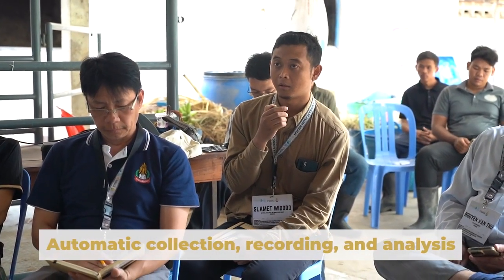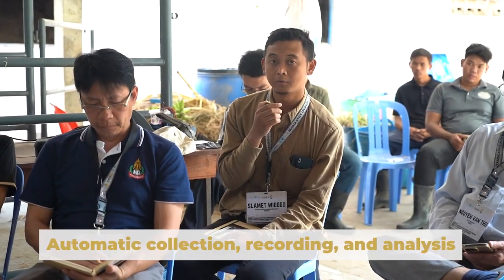My name is Widodo from Indonesia. And we have in Indonesia a Cybel system produced by Cybel System America, and that's an automatic sampler. So we have 4 headboxes in Indonesia, and that measures sequentially with the headbox and the background correction, and it can be measured during 24 or 48 hours automatically, and the data will be stored on our computer, and the gas will be automatically analyzed by the gas analyzer, such as the methane and the CO2.